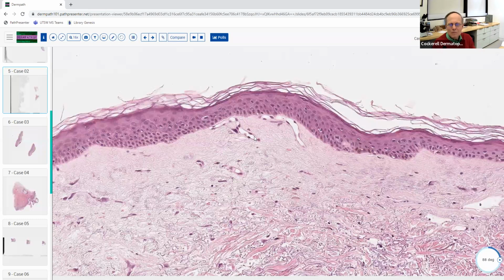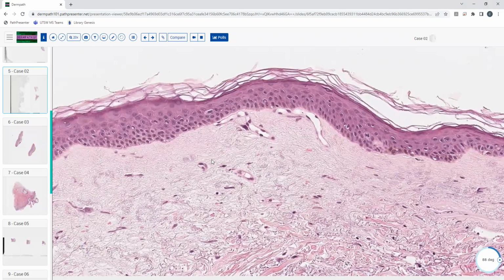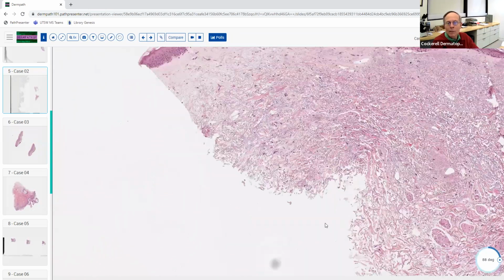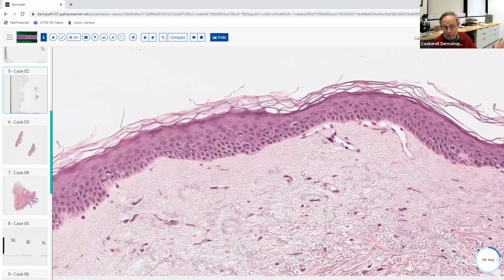Now, I don't think the board examination would expect you to distinguish among the sclerotic disorders that you can see here, but name a couple of other things that can give you sclerosis in the dermis, primarily, that you have to be concerned about when you see sclerotic collagen like this. I mean, so the differential I was thinking was like a burnt out morphea, basically. That's one thing. Yeah, morphea can definitely give you sclerosis. Of course, that you would think would kind of involve the lower part of the collagen and whatnot. But yeah, exactly. That's why I was kind of leaning towards the radiation. Yeah, which you're right. That's the correct answer here.